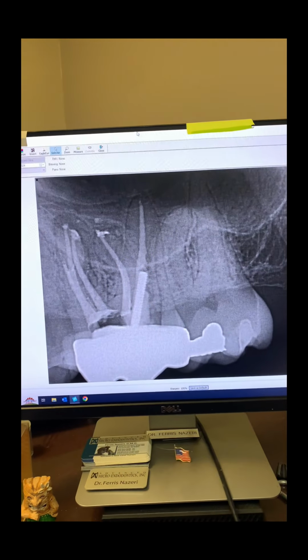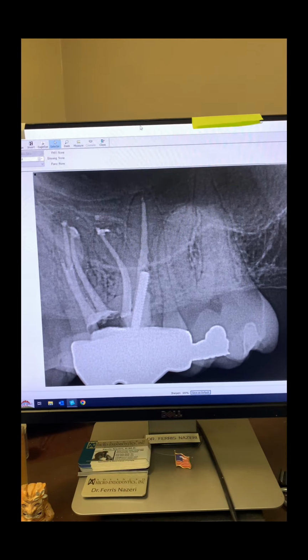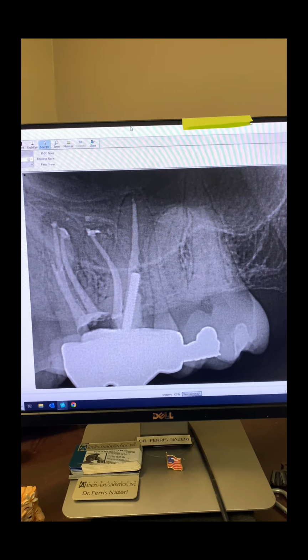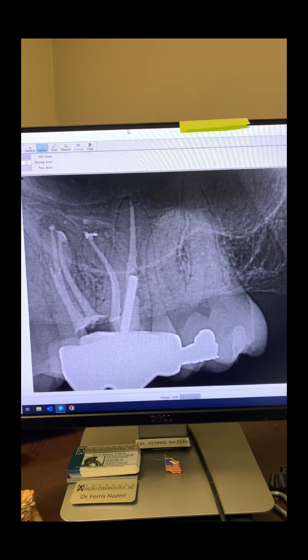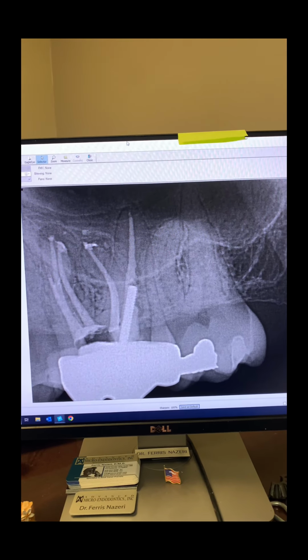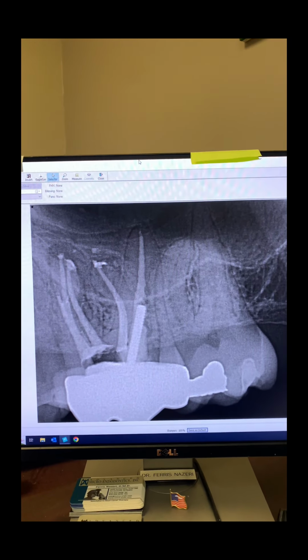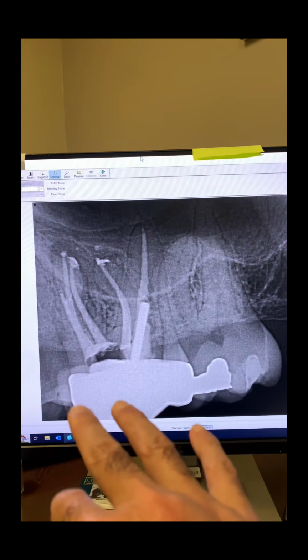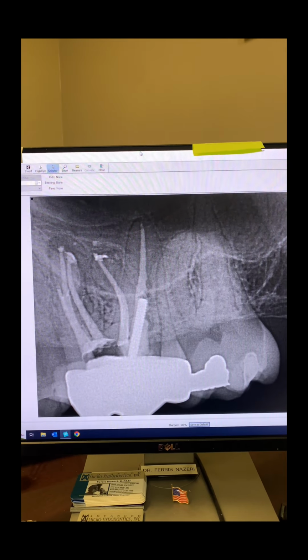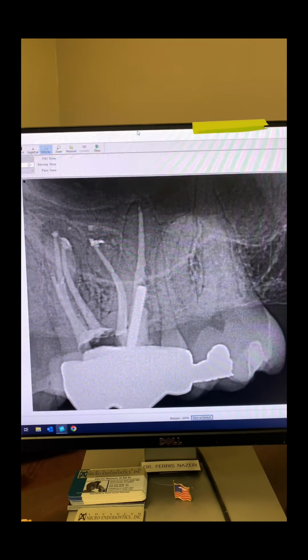But this is how we're supposed to be doing root canals, and even as you saw, us endodontists sometimes miss. No excuses, but nobody's perfect. I wish he had done a better job the first time around, so we didn't have to correct a lot of mistakes, and this patient didn't have to suffer and pay for another endodontic retreatment. But here it is. Excellent.